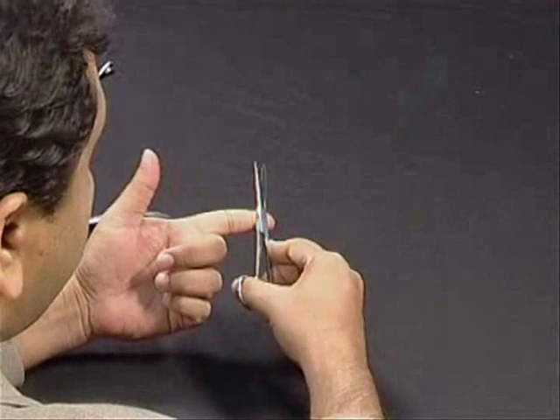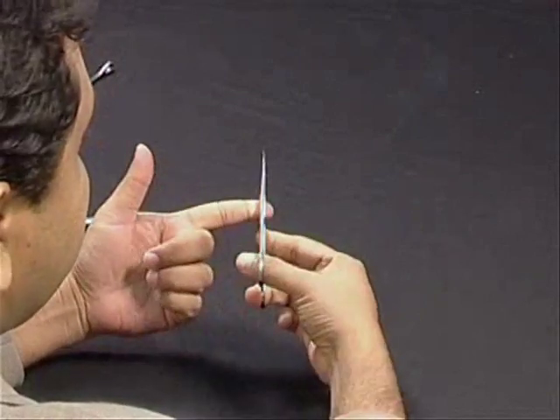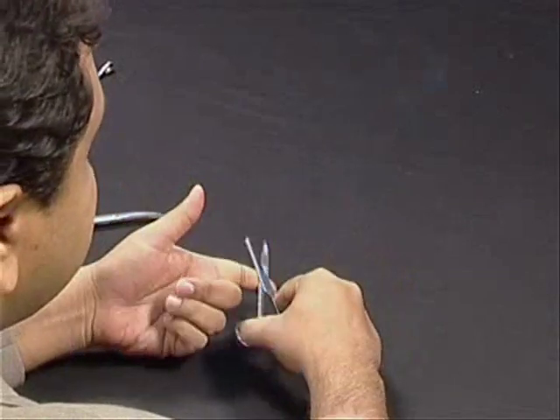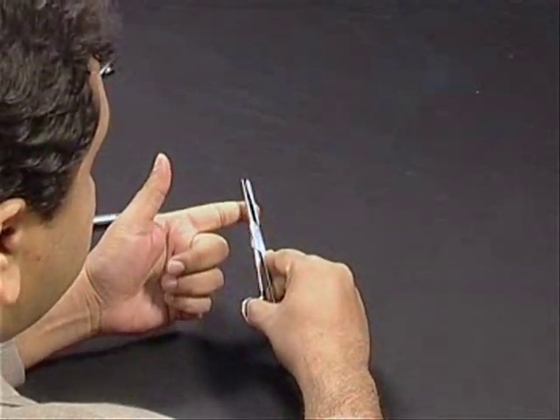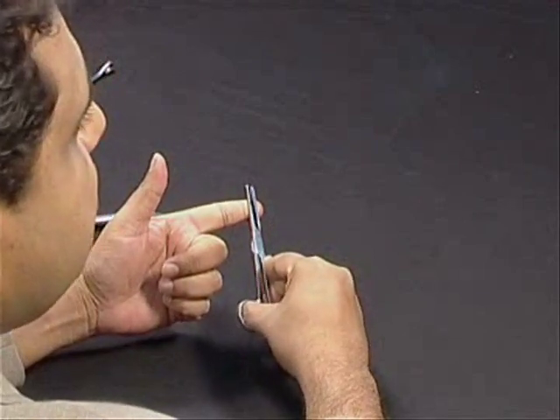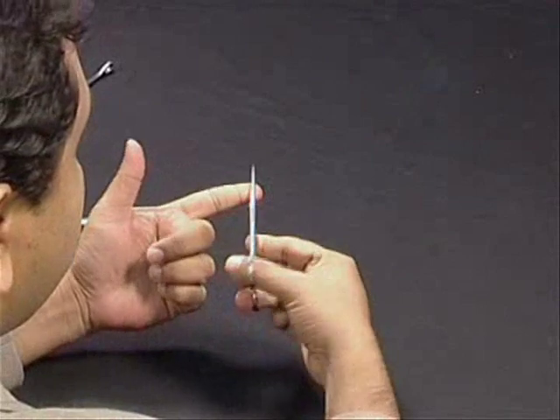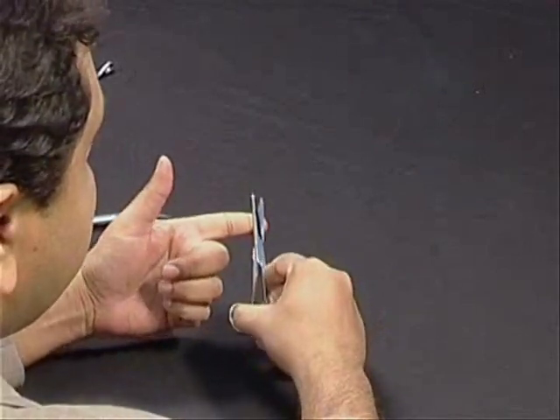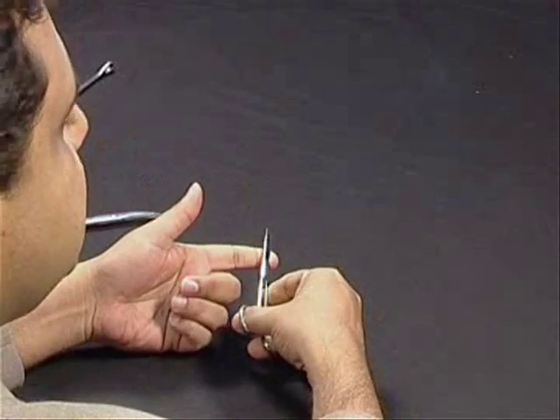Always support with a finger from the opposite hand, and then using the same technique as how you hold a needle holder, you could cut structures. Another method is to keep your other finger at a distance, which will help you determine how much tissue you want to cut. If you want to cut less muscle or less fascia, you keep it at that particular distance and with a controlled movement cut that structure.